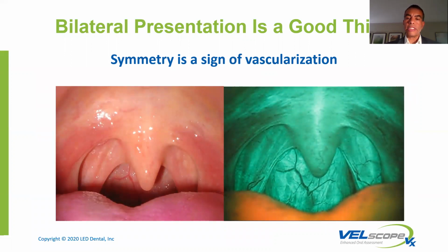So what I would suggest is use this as an opportunity. Hey, Ms. Smith, I noticed there seems to be a little inflammation in your tonsils. Do you have any allergies? Something that's causing irritation? And why is this important? Because you're talking about soft tissue, right? Make sure you utilize the opportunities to talk about soft tissue so patients understand you are about oral health. You're not just about teeth and fixing teeth. You're about making sure that the total oral health, which includes teeth, which includes gums, which includes tongue and soft tissue, are in good condition.